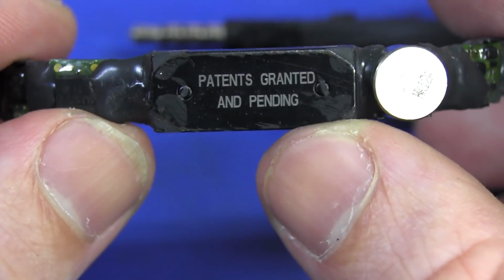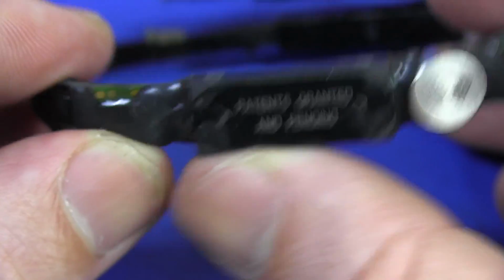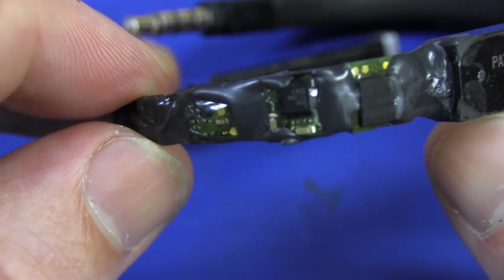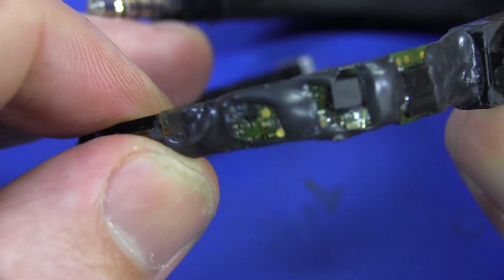So anyway, patents granted and pending. I'm assuming that is the battery in there, and there's no other circuitry under there because we can see some chips on there. We'll take a closer look, but they seem to be on almost like separate boards.